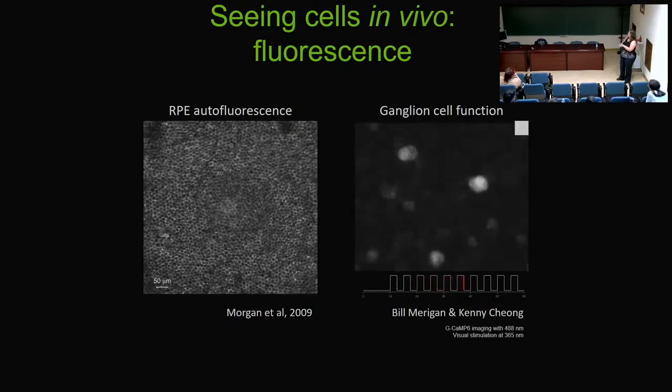And if you actually look, the two cells, see if I can get the mouse working up here. I'm pointing. There we go. These two here were counter flickering, and one was an on cell and one was an off cell. You could actually see them in counter flicker.